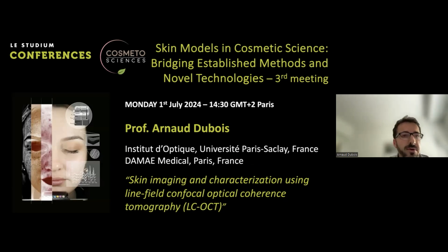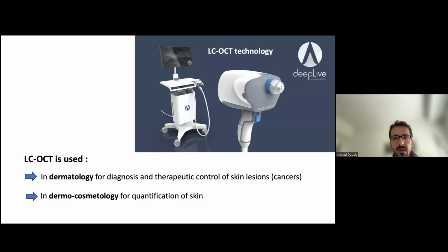And thank you for inviting me to talk about the imaging technique called line field confocal optical coherence tomography, LC-OCT. LC-OCT is a technique invented in my lab at the Institute of Optics, and which is industrialized by the company DAMAE Medical. And this imaging technique is used in dermatology for the non-invasive diagnosis and the therapeutic control of skin lesions, including skin cancers.